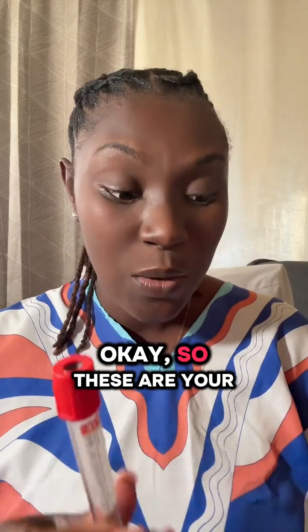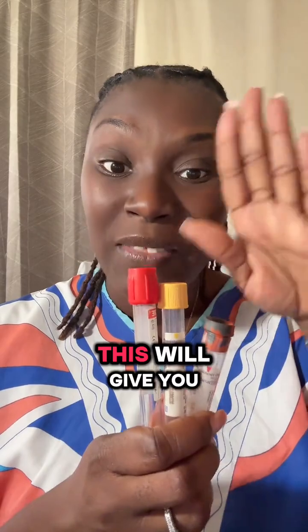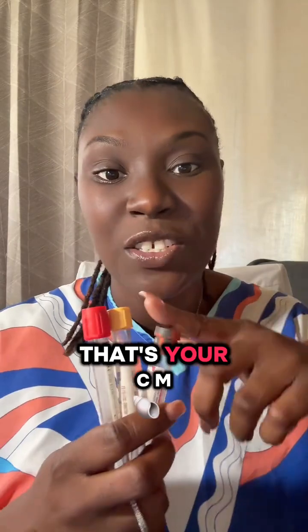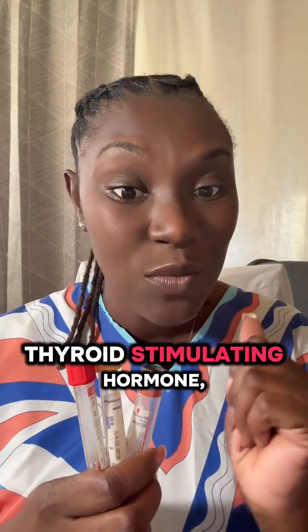Okay? So these are your clotting activators. This will give you serum. They need to sit to clot. Give you serum and send to chemistry. That's your CMP. That's your TSH, thyroid stimulating hormone. Lipid panel. BMP, basic metabolic panels.